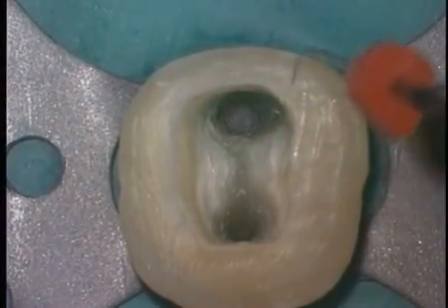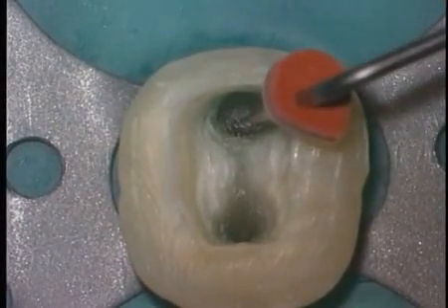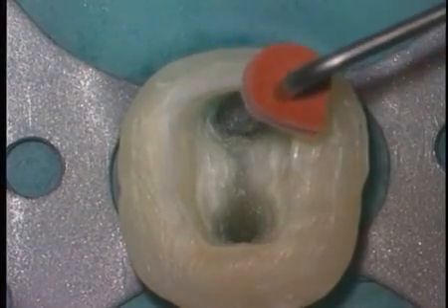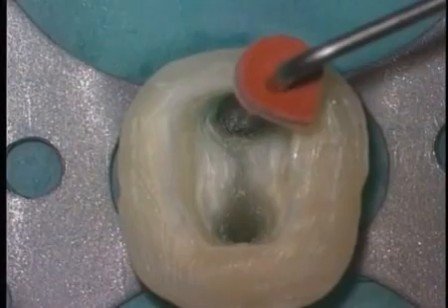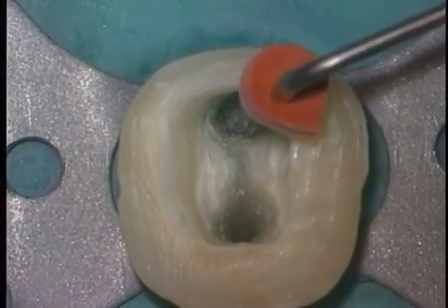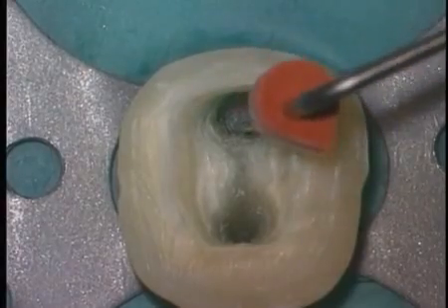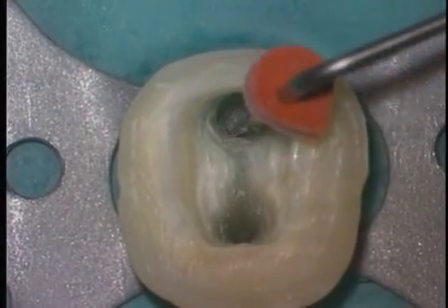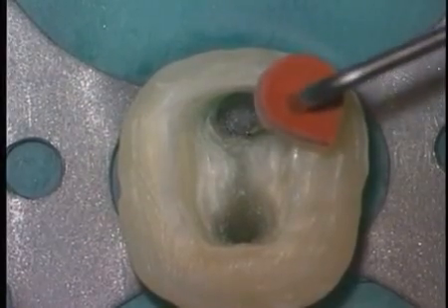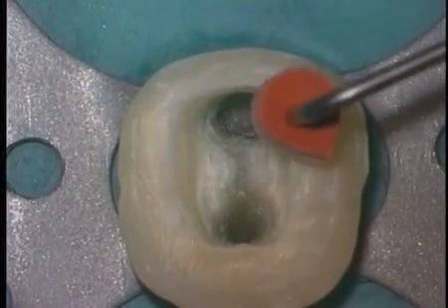The instruments can be pre-curved and have unidirectional stops, and once we kick it past the ledge, a little push-pull motion repeatedly makes the opening into the true pathway a little bit larger and is an opening for placing more conventional instruments. Micro-openers give us unsurpassed vision, as there is no file handle or fingers to obstruct vision.